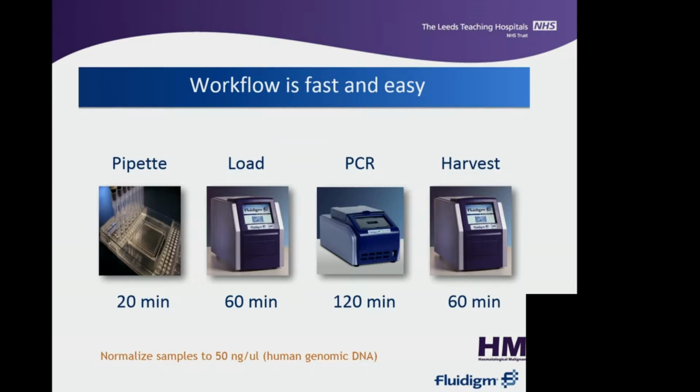We then transfer it to a post-PCR lab, where we put it onto a very similar or almost identical controller unit, and we harvest it. Basically, our PCR products are pushed in the opposite direction. So for every well where your original DNA sample started, you now have, well, in our case, for the myeloid panel, 361 separate amplicons present in that well. We then perform library cleanup, so we clean it with conventional AMPure beads. We then tag the libraries with individual barcodes, clean those up, we amplify those up to attach the barcodes, clean the samples up, and then we add to a MiSeq.